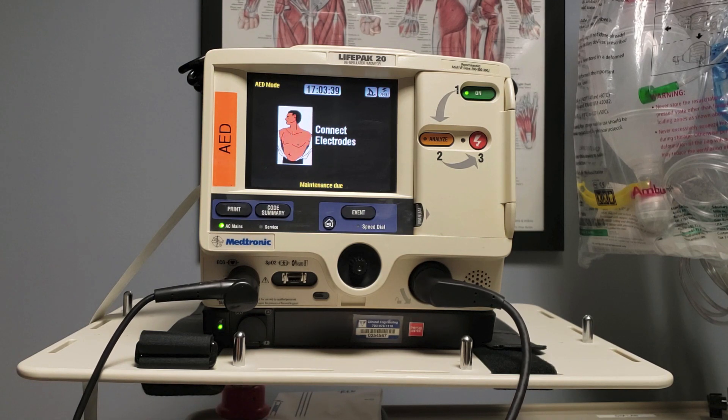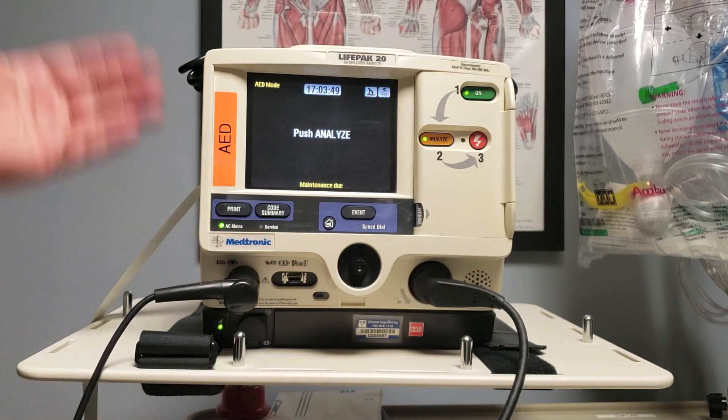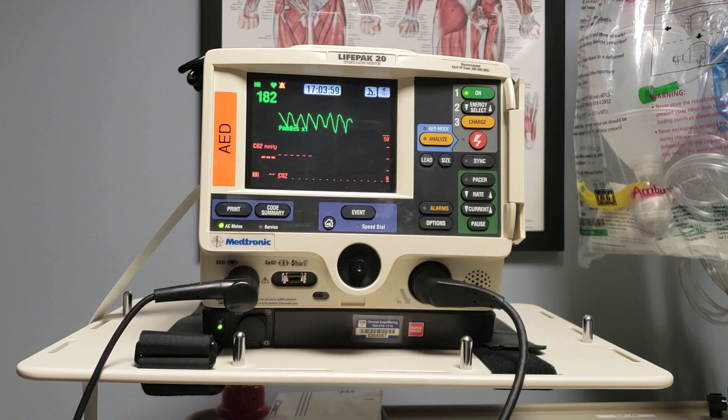So once I get that on my patient and I've connected it, it's then going to tell me to push analyze, and I've met a crossroads. For the BLS trained nurse, I can go ahead and push analyze and let the LifePak 20 do its thing. Or for the ACLS nurse, I can go into manual mode by pushing this and opening this door, exposing all the advanced functions, and as you'll see, this also brings up the patient's real-time rhythm.